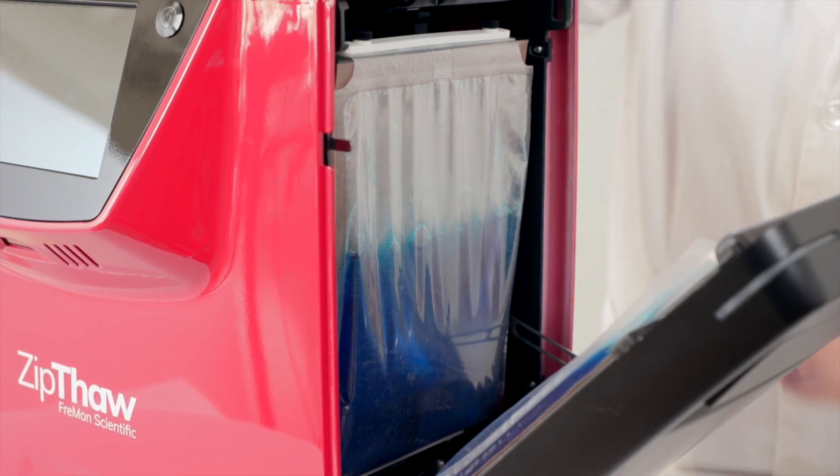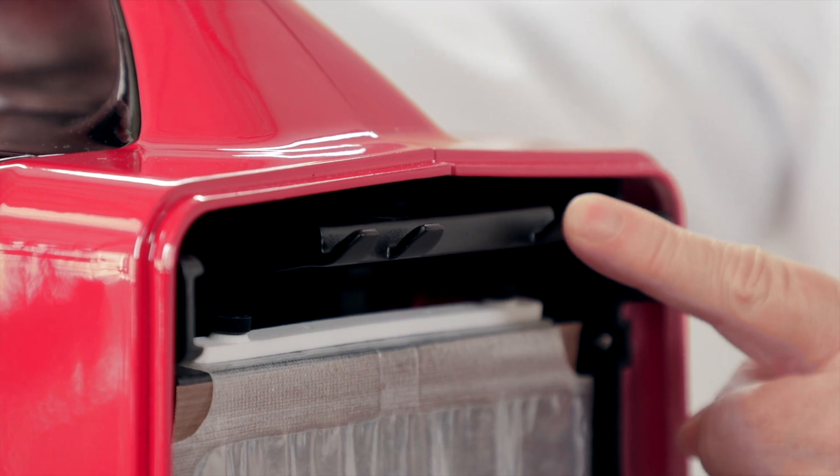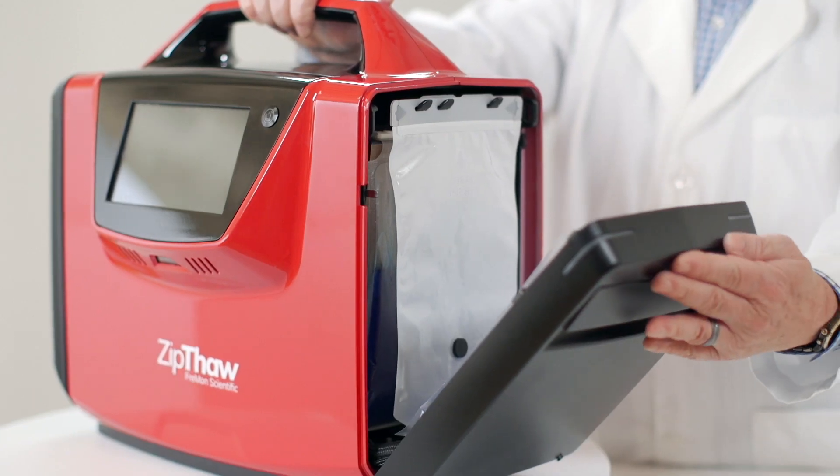This is one of the thawing chambers. Here's the latch and the warming cushions. Note how these hooks orient the loading of the Zip Sleeve so it cannot be loaded incorrectly. Now I'll close the door.